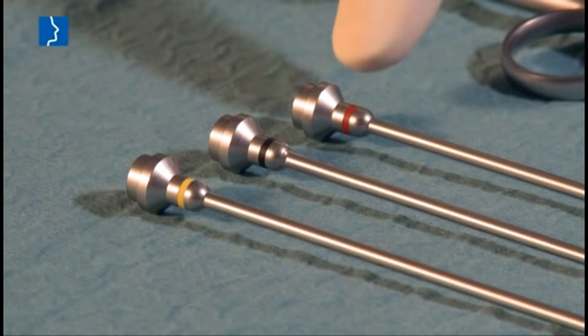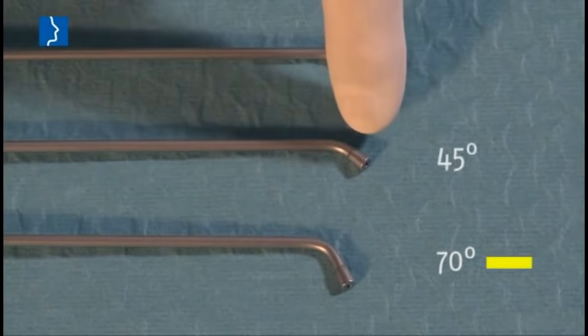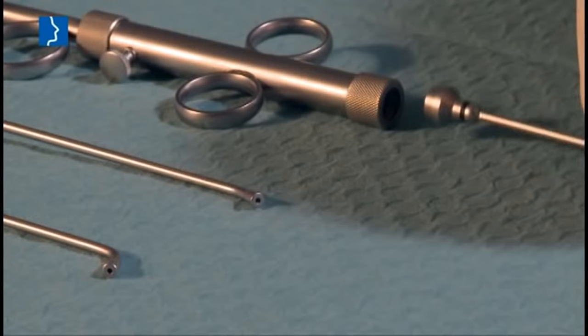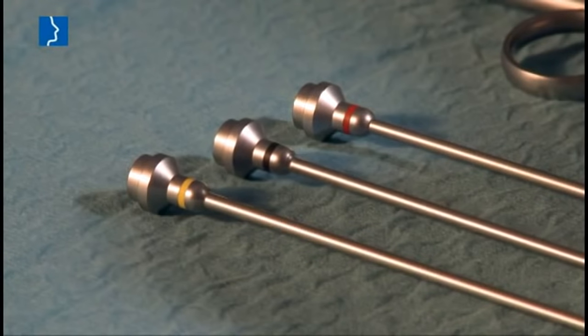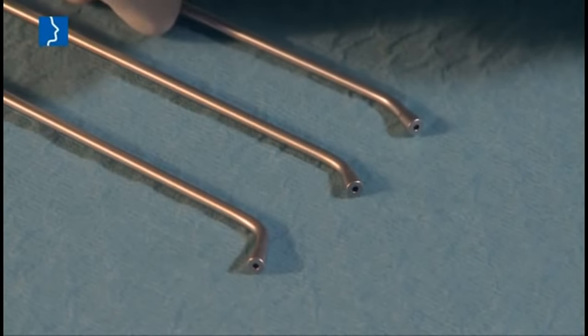The instruments comprise three attachments that are color-coded and tilted at 70, 45, and 30 degrees. All distally tilted attachments can be used with the insertion instrument, depending on the patient's anatomical conditions.